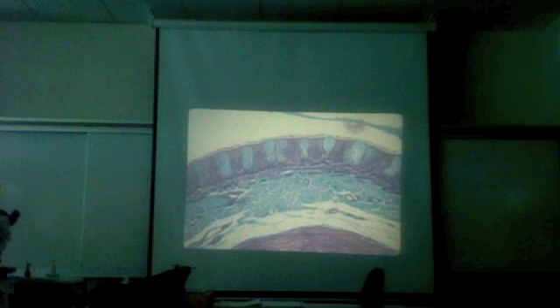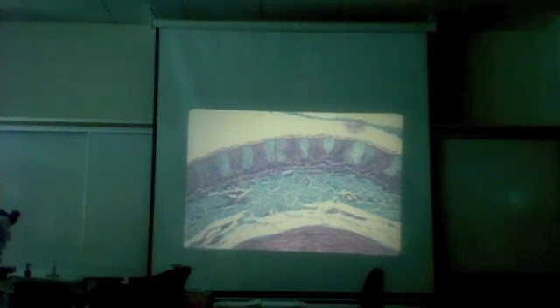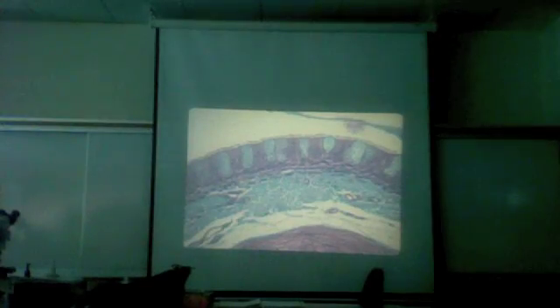Oh, another version of what? Yeah, the same old. That one's a little more realistic than that other one. Those funny looking flagstone nuclei. I don't know what happened to those. They look like they got dried out. I've seen that same picture in so many textbooks. Not this one, but that other one, where the nuclei look like flagstones or something. They don't look rounded like a nucleus. They use that all the time in textbooks, but it looks like they got all dried up when they made the slide.